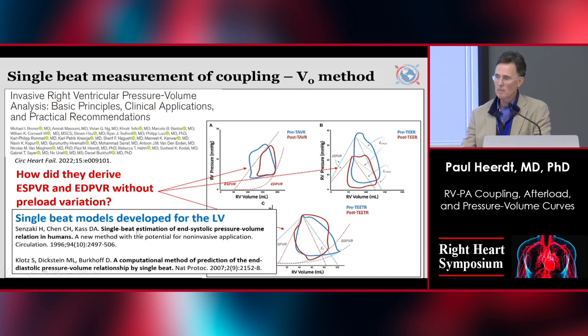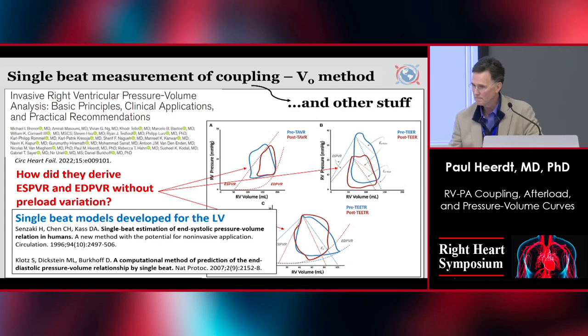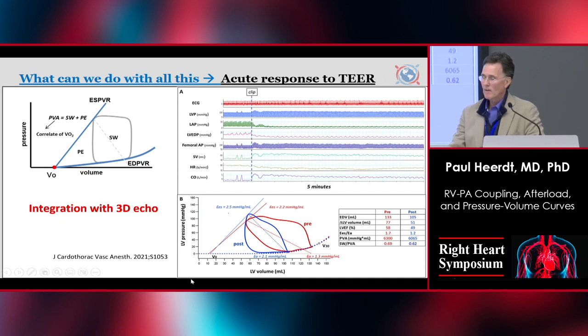Not only can they estimate the end-systolic pressure-volume relationship, or contractility, but this is also a way of estimating the end-diastolic pressure-volume relationship, which is interesting to me because now we may have the capacity to generate more of these classic metrics based on pressure-volume analysis that we might apply at the bedside, if we take our standard right heart cath along with, for example, a simultaneous echo. That's why I say other stuff. That caught my eye too, because we had done a very similar thing in patients having a mitral clip. Could we take the classic pressure-volume analysis and derive metrics using a combination of 3D echo and actual pressures?